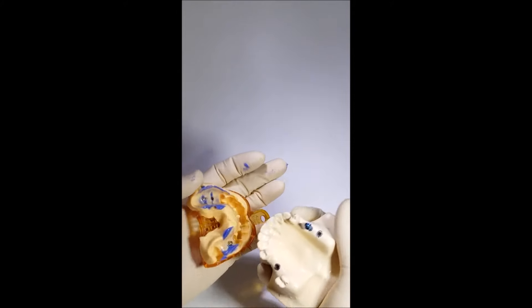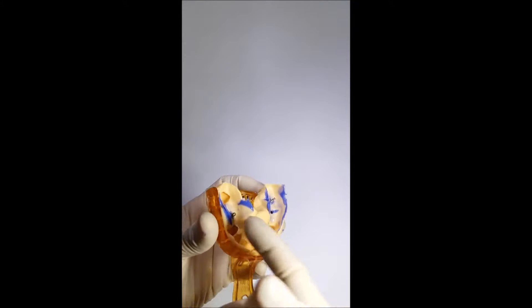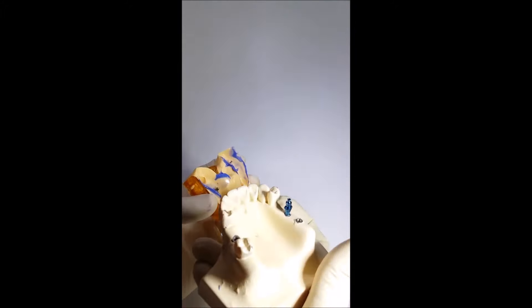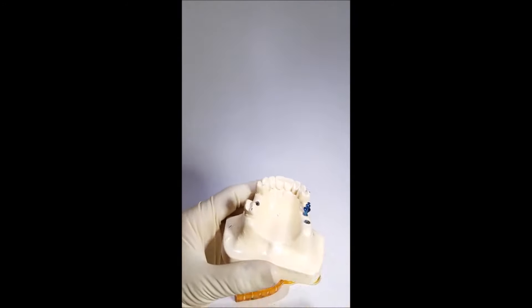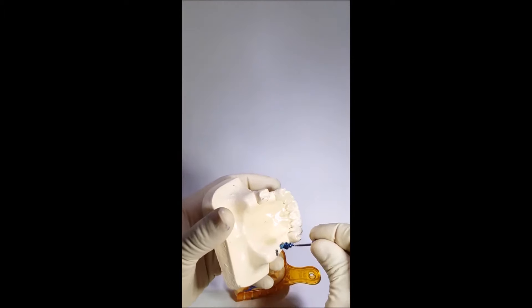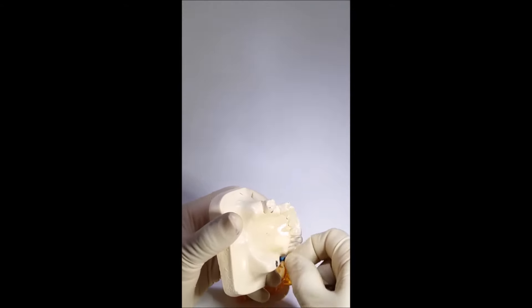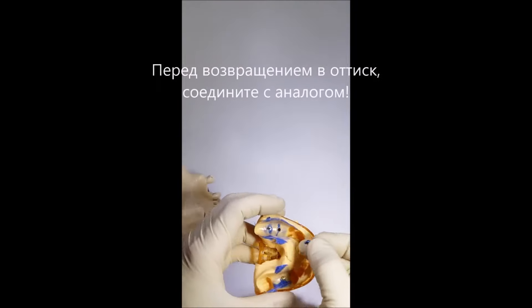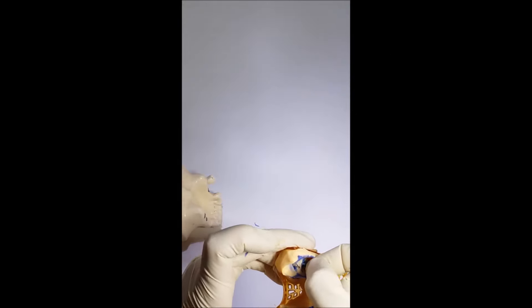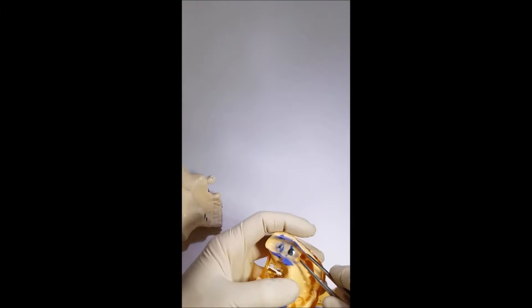What do we see? The transfer with clips remained in the tray inside the impression paste. The open tray transfer also remained in the tray, while the closed tray transfer remained in the model — that is, in the oral cavity of the patient. Note that the overall impression image is not as perfect as it was with the clip fixation transfer and the open tray transfer.